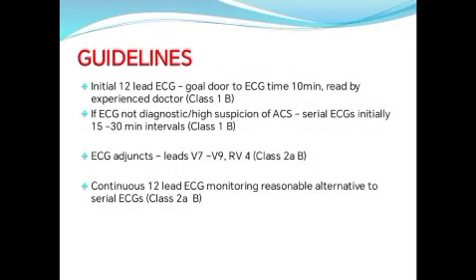Then, if we talk about guidelines, the initial 12 lead ECG goal door to ECG time should be 10 minutes. What does that mean? That means the ECG should be done within about 10 minutes from the arrival of the patient, and it should be read by an experienced doctor. This is a class 1 recommendation.